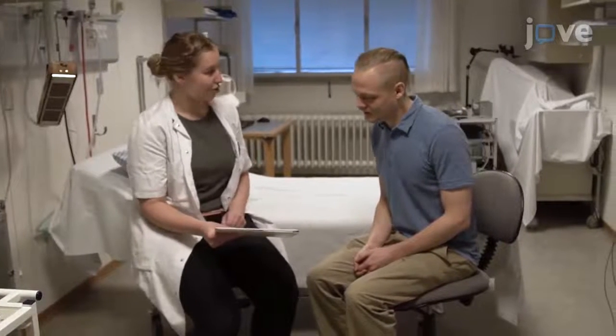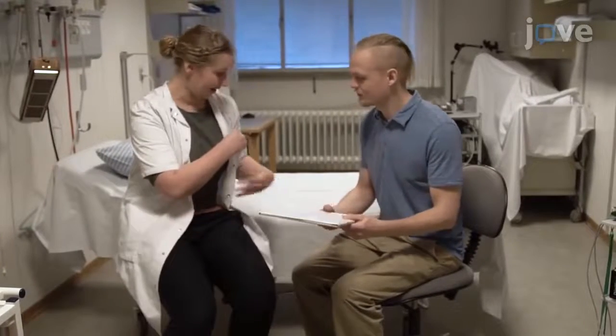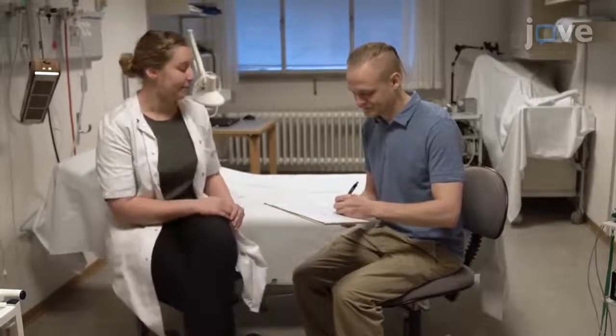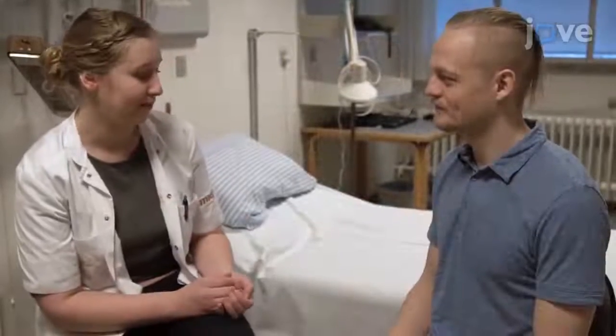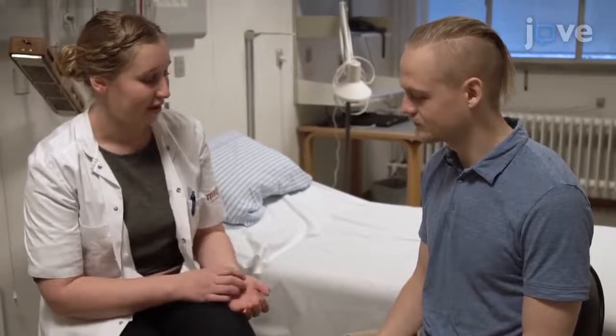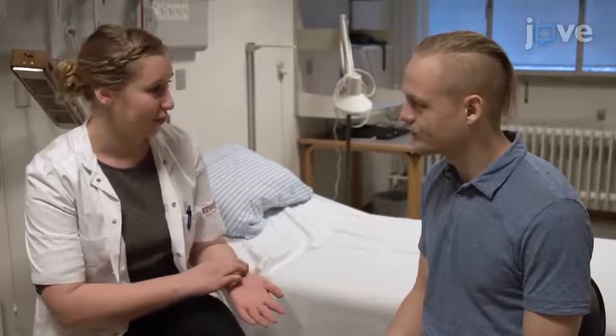To begin, request written consent from the subject. All subjects must give their written consent prior to the examination. Then, explain that the subject will experience a tickling sensation in their hand and wrist, and that the examination can be halted at any time should they experience too much discomfort.